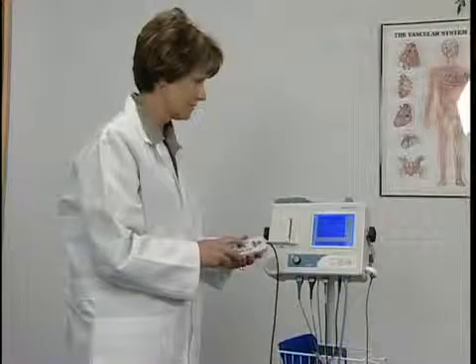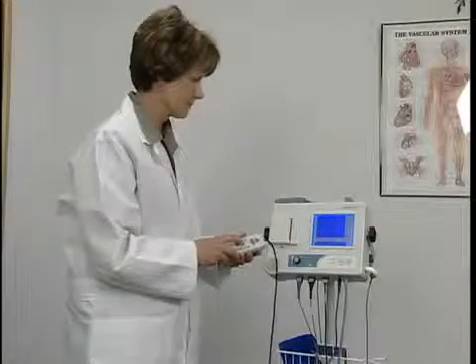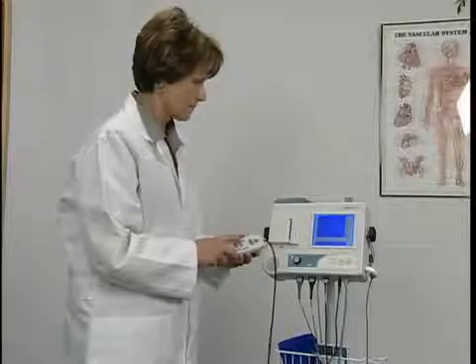The system operates from either its internal battery pack or from an external power supply. For first time use, allow the system to charge for at least one hour prior to operating from the battery.